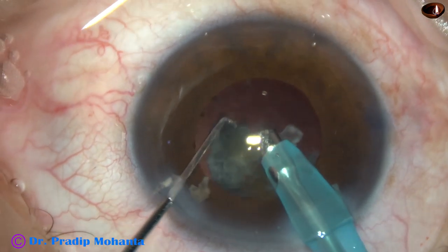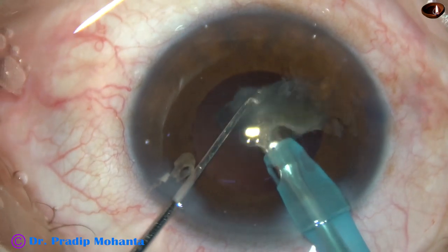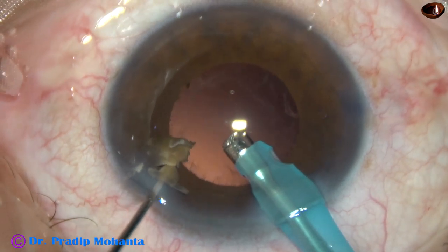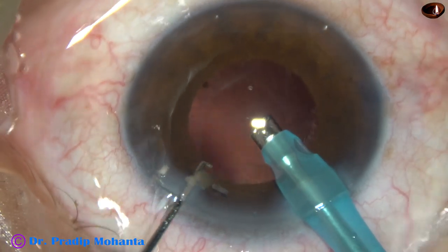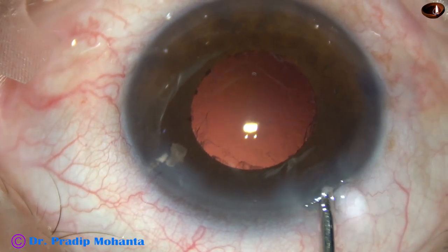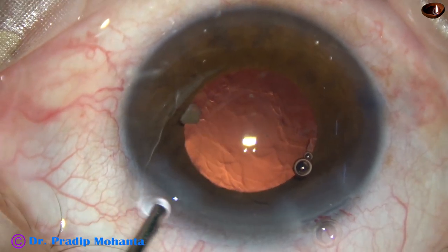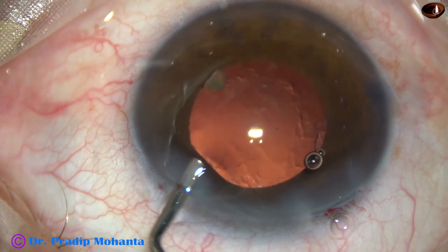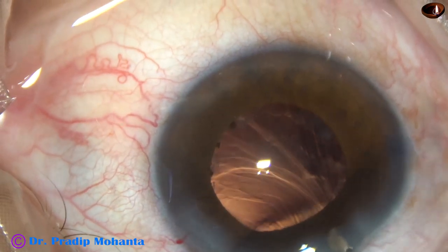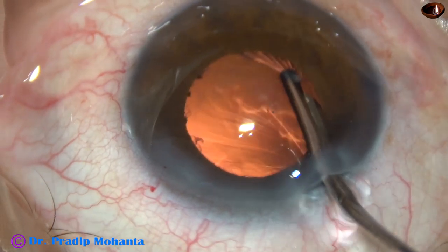For emulsification of the last fragment, the chopper has been removed. A small nuclear fragment is near the left side port. Before we remove the cortical matter, we must take care of this fragment. We must remove this small nuclear piece first; otherwise it may get lost somewhere under the iris and it may be very difficult to remove. So I scoop it out with the help of a Simcoe cannula, and now I start removing the cortical matter.